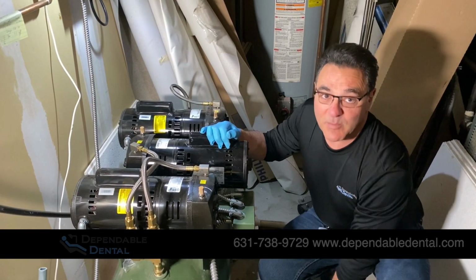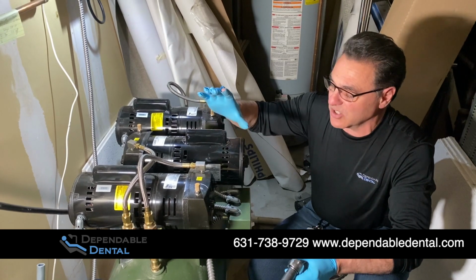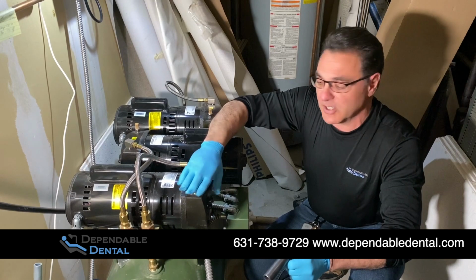Hi everybody, this is Al Monteleone from Dependable Dental, and today we are doing a surgical suction maintenance. We're going to be changing out the filters in the muffler. We'll show you how to do that.